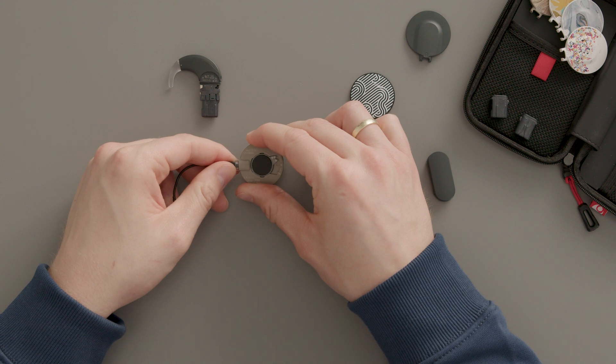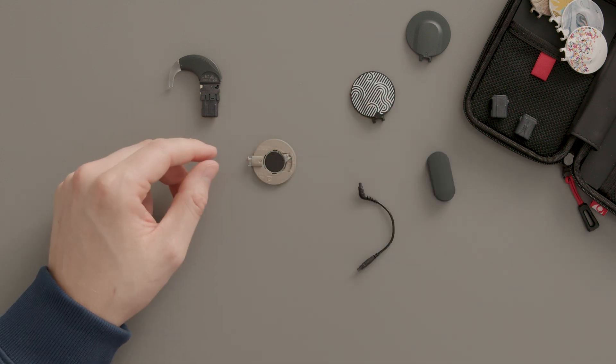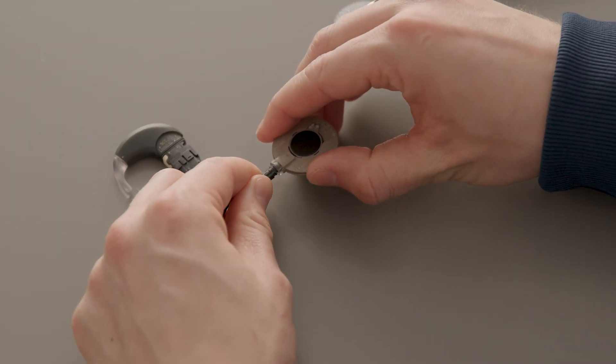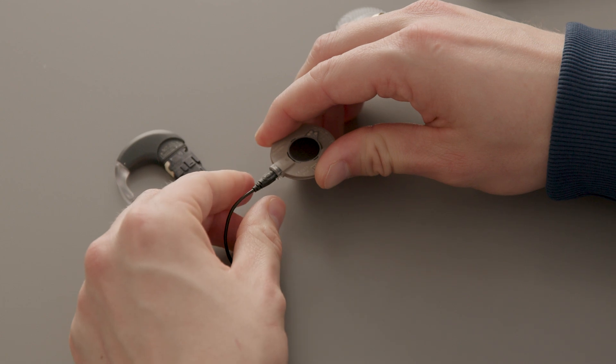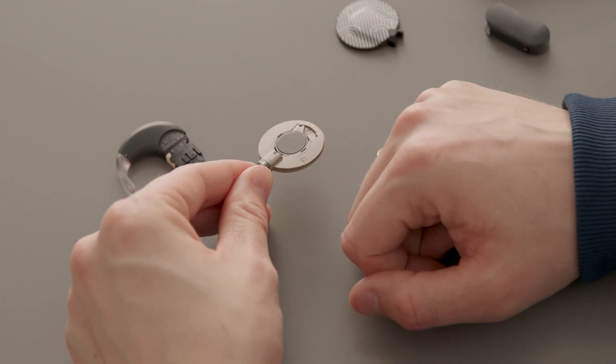Remove the old coil cable from the base and insert a new one. Note the orientation of the plug — the logo and arrow should face up. Make sure the magnet is not in the center position, otherwise the cover cannot be attached properly.